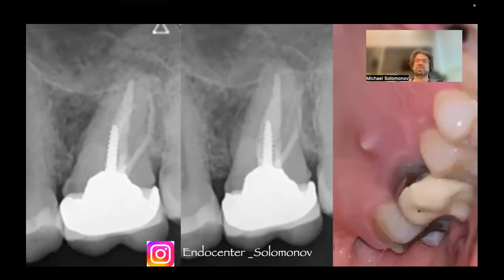Now the pockets, you can see radiolucency in the lateral area, also in the apical area a little bit, and some strange form of the roots. And not so good crown. We see here a leakage and maybe secondary caries. And in a differential diagnosis, I put chronic apical abscess, of course, and also suspected vertical root fracture. For this reason, I referred the patient for a CBCT scan.